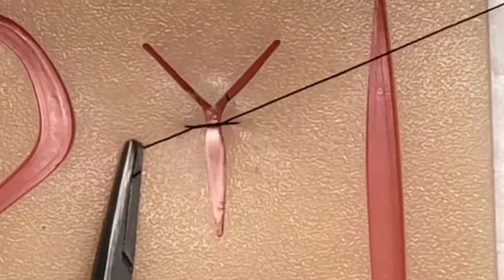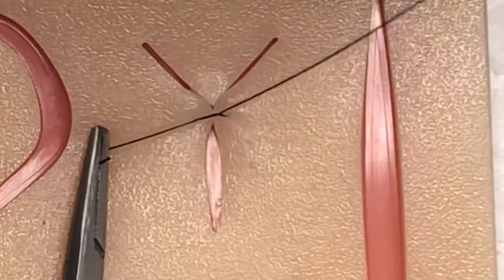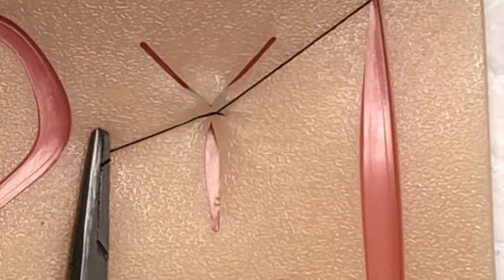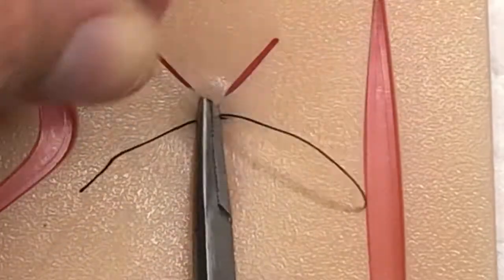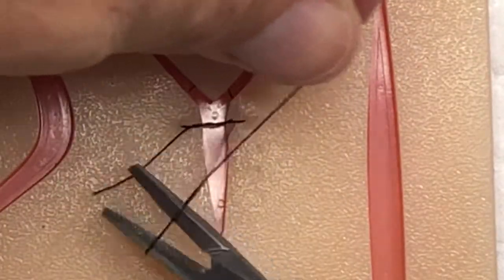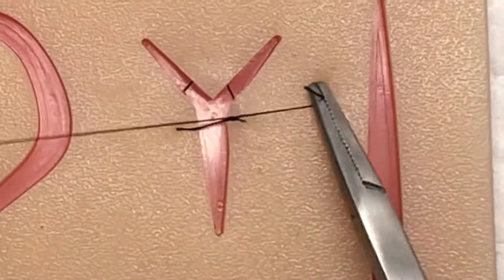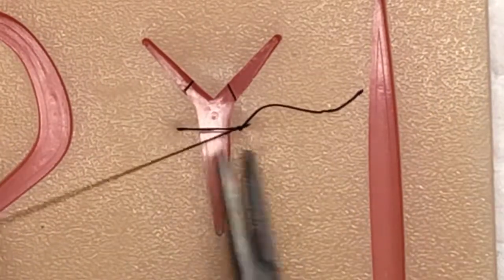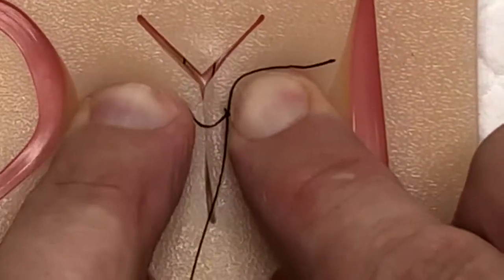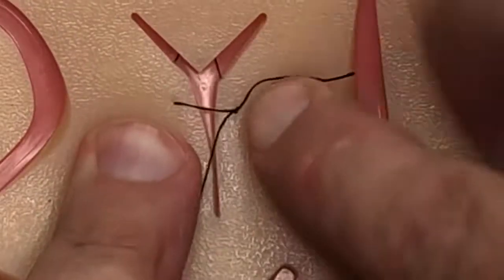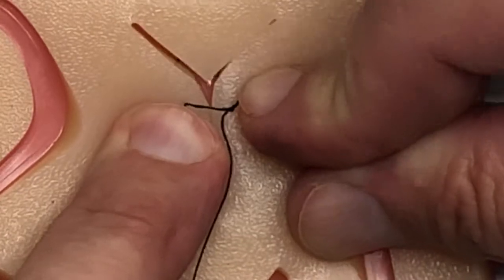And then I'm going to see how this does. Yeah, just with the silicone kits, it is a little bit more difficult, but I'm going to try to bring this together here. That may not work. But that's essentially what you're trying to do, is bring everything together utilizing this kind of like a modified mattress suture. And that's going to bring everything together.